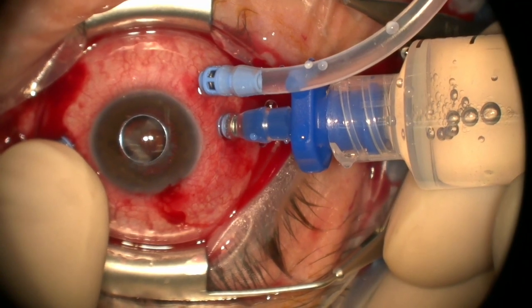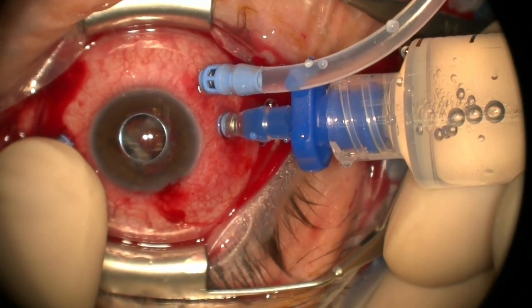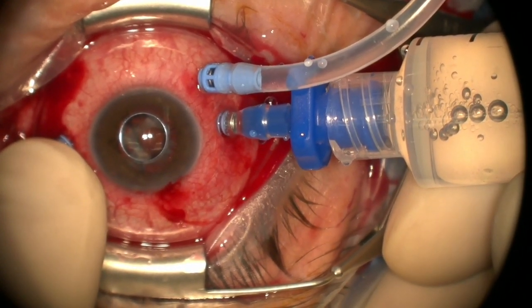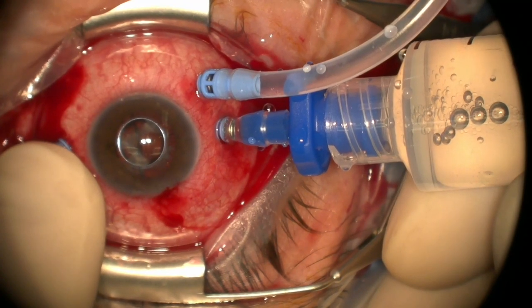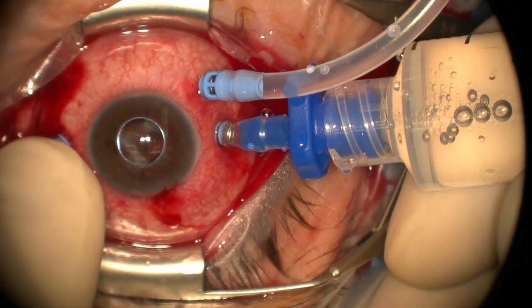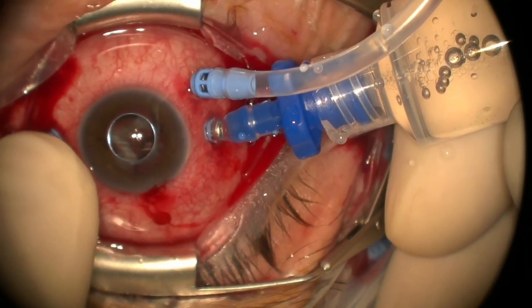And, you know, I would be hopeful, depending how the macula does and how much macular damage there is, that with a lens implant, all said and done, we get you to the middle of the eye chart. Now we can see the oil coming across the eye. There in the back, you can see the meniscus. So we're almost done with this.